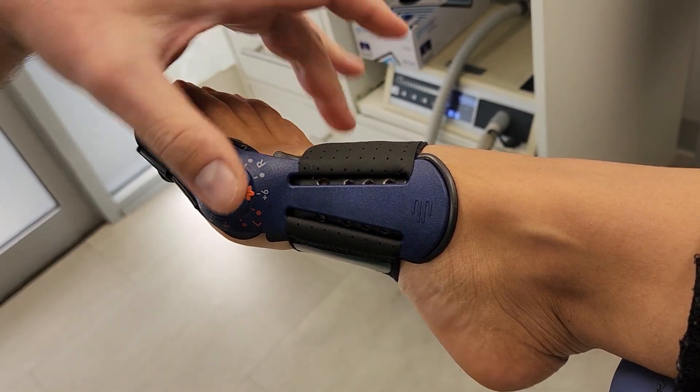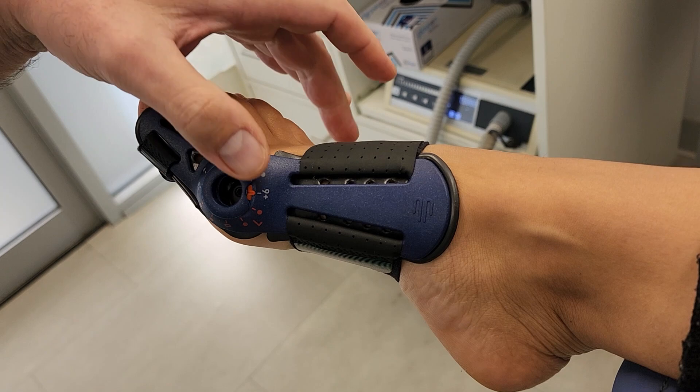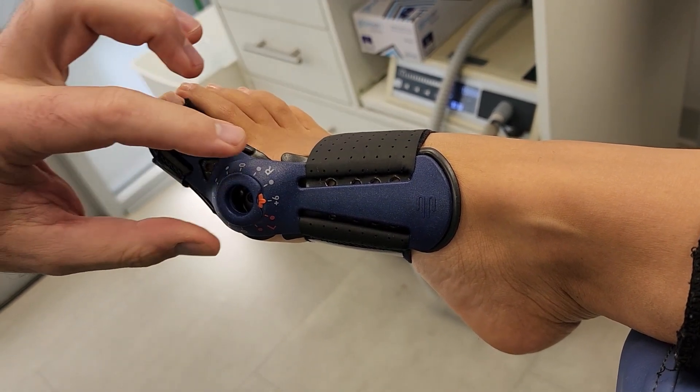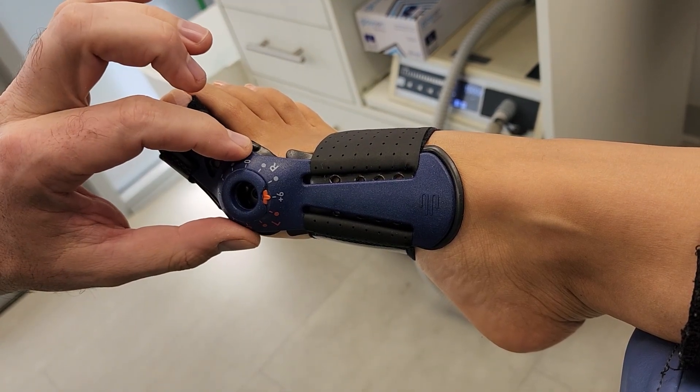You do need a shoe that's a little bit wide because you've got this apparatus, so it will poke through the shoe a little bit. But if it's like a jogger, I haven't had anyone have a problem with that.